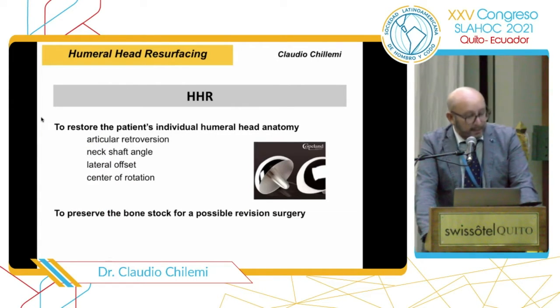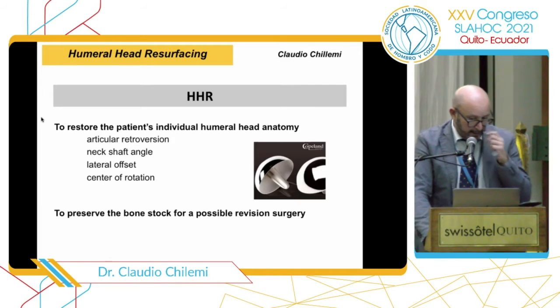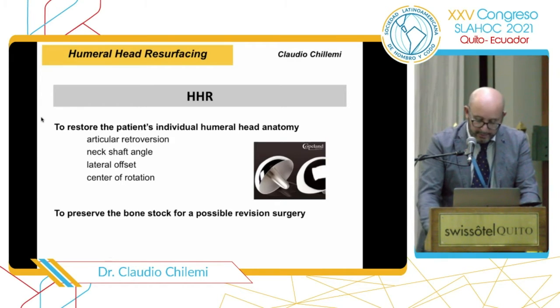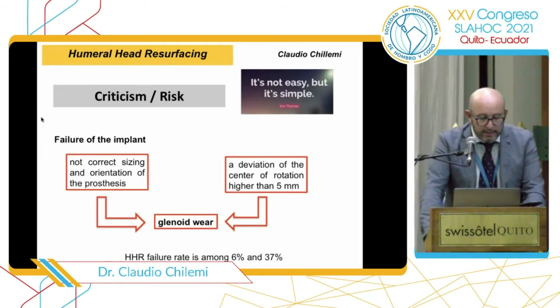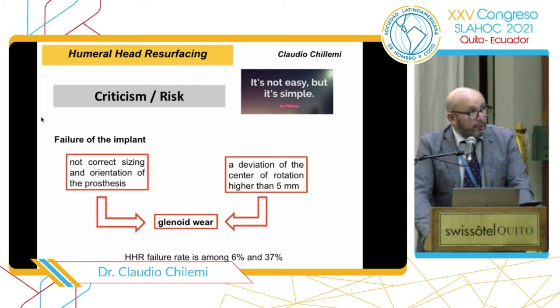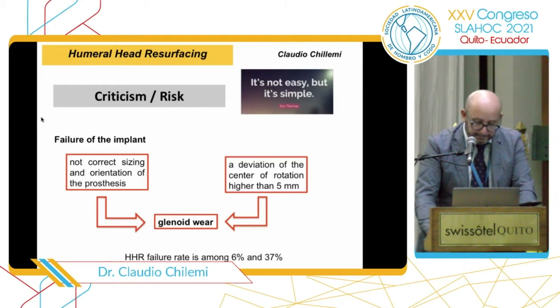The aim of humeral head resurfacing is to restore the patient's individual humeral head anatomy, such as articular retroversion, neck shaft angle, lateral offset, and center of rotation, and to preserve the bone stock for a possible future revision surgery. The criticism of this implant is that it appears simple, but it's not easy. It's the failure of the implant. In fact, the correct positioning and the orientation of the prosthesis is fundamental to prevent glenoid wear.